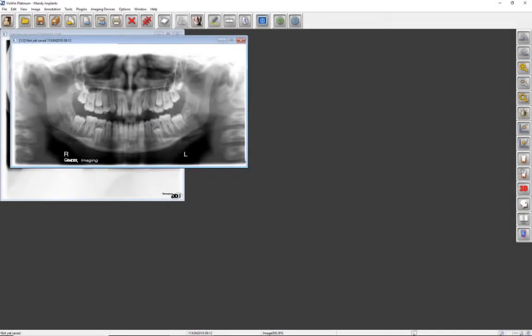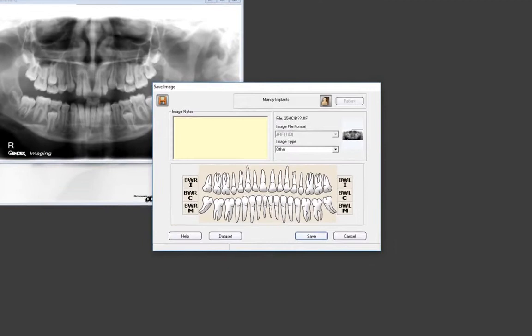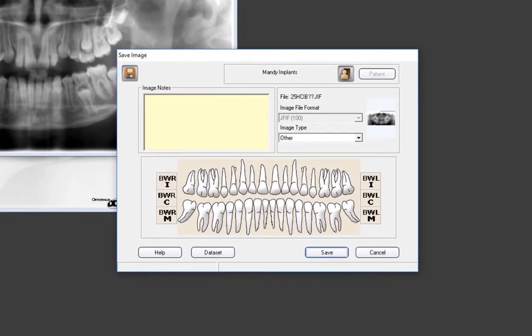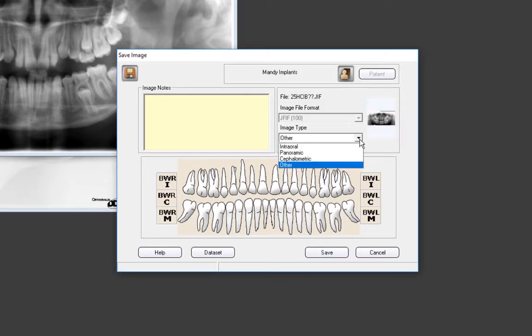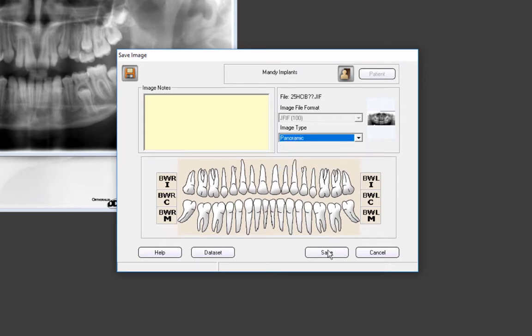Now let's take a Ceph and a panoramic x-ray. Let's click the Save All Images toolbar icon to open the Save Image dialog window. The last image taken will appear first in the Save Image dialog window and its thumbnail image will be displayed. Let's choose Panoramic in the drop-down and click Save. The thumbnail image of the Ceph will appear. Let's select the image type and click Save.